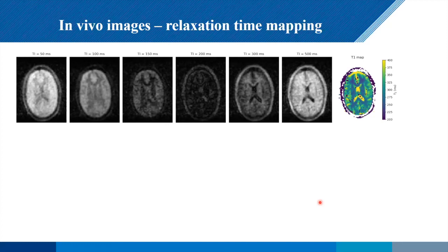So in terms of quantifying relaxation times, which are going to allow us to optimize pulse sequences, but also potentially allow us to do some segmentation of tissues, getting accurate measurements is important. So this is some of the data that Tom will be presenting at ISMRM.